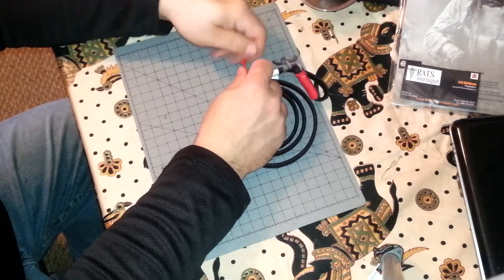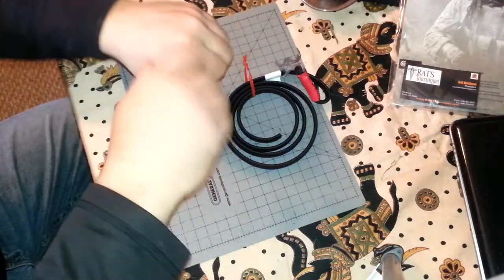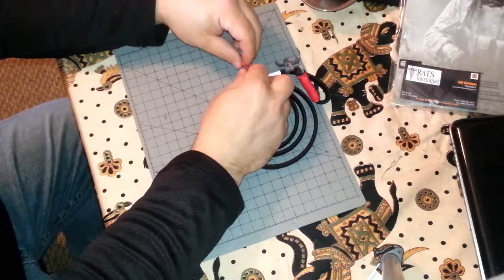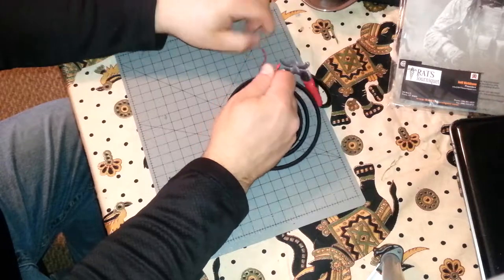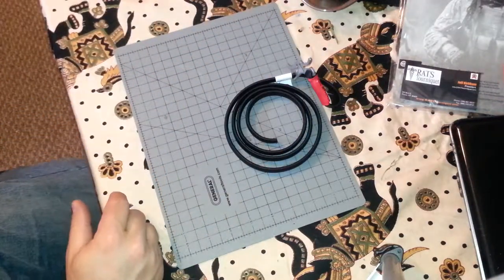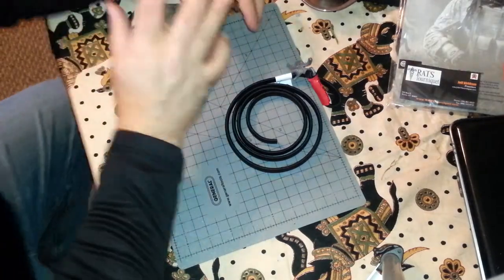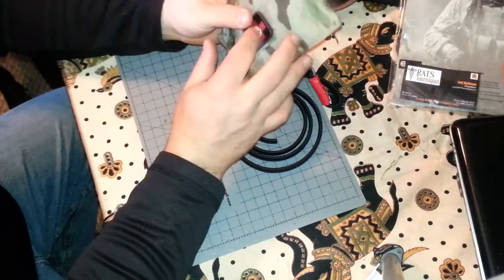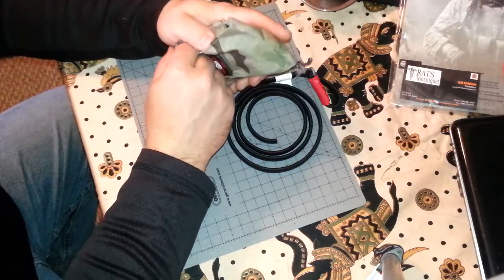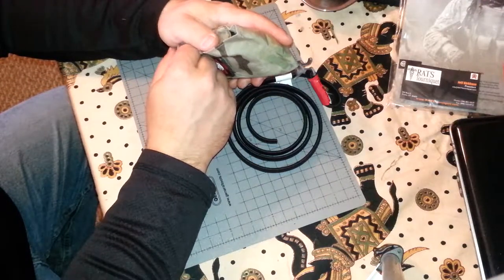I believe it was $12 or $13 a piece. A lot of other tourniquets cost double or even triple that amount, and they are not as easy to use or remove. Many use a windlass style — you wrap the strap and twist it down all the way. It takes more time, and let's be honest: seconds will determine whether you live or die.